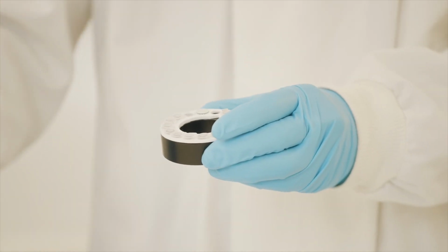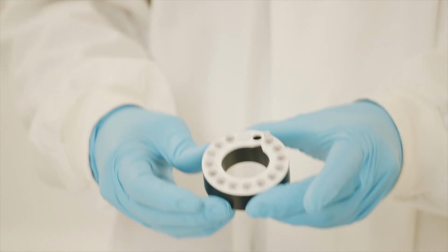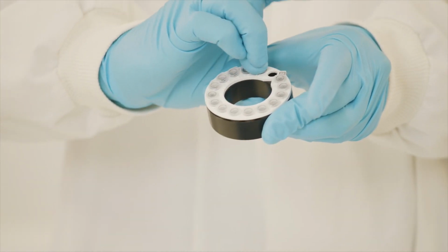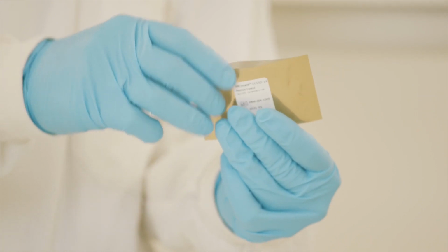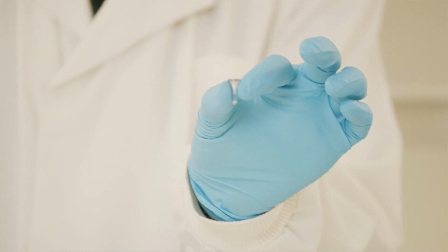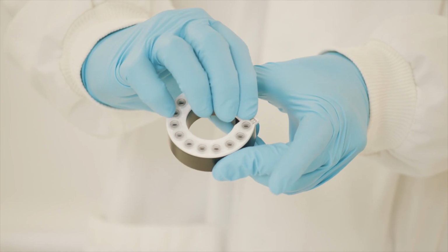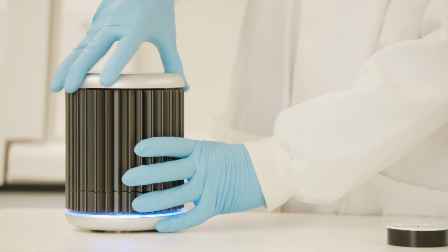After all samples have been added to their reaction tubes, remove the foil from the tube in position N and add 5 microliters of the negative control solution and seal with the lid provided. Finally, open the positive control pouch and remove the prepared positive control tube. This should not be opened. Ensure liquid is at the bottom of the tube and place in position P. Place the filled magazine in the correct orientation in the instrument.